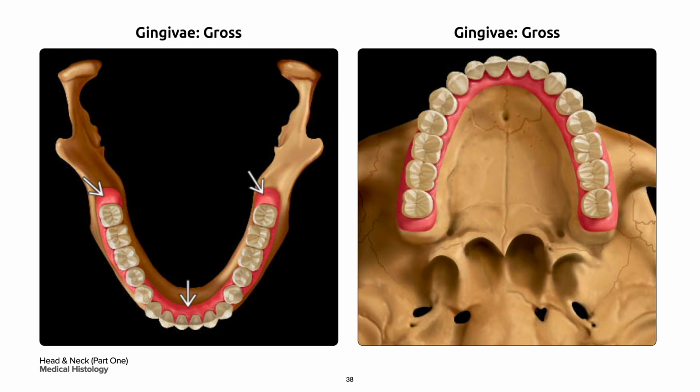On your right is the free gingiva, which is involved in the forces of biting and chewing food, exposing the gingiva to mechanical forces such as compression and shearing. Additionally, the tissues are exposed to numerous microorganisms found in the normal oral flora, and the gingiva is helping to provide a barrier to infection.